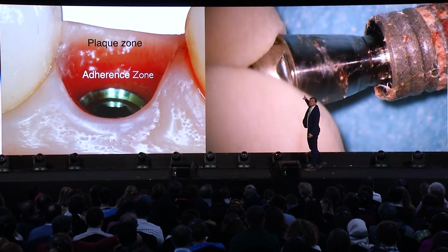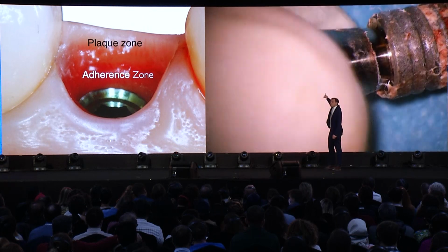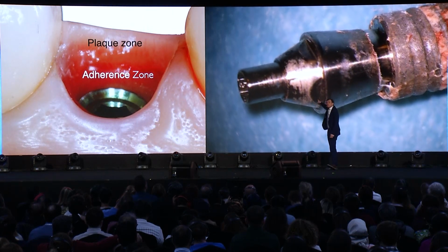Because just having vertical tissue thickness is not enough. As I say, vertical tissue thickness is a possibility to get crestal bone stability. How we are going to use it depends on the prosthetic material. On the prosthetic, not implant, on prosthetic material.